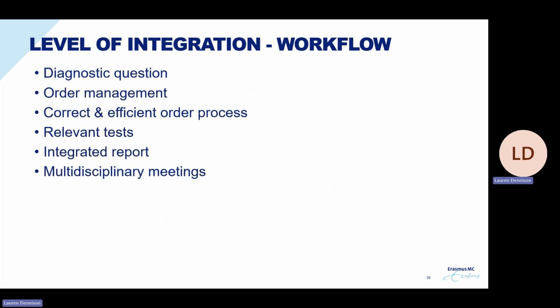So the workflow integration can be at the level of the diagnostic question. I think we should ideally have the same question on both sides. At the level of order management, so in our institution, this has been harmonized, and that also includes an efficient order process. Ordering the relevant tests from different specialties, perhaps not between radiology and pathology, but it may be important if you think about other specialties, not to double up tests that are not potentially useful. Then providing the integrated report and then sending that through to the hospital management system or information system. And lastly, how to integrate this at multidisciplinary meetings.